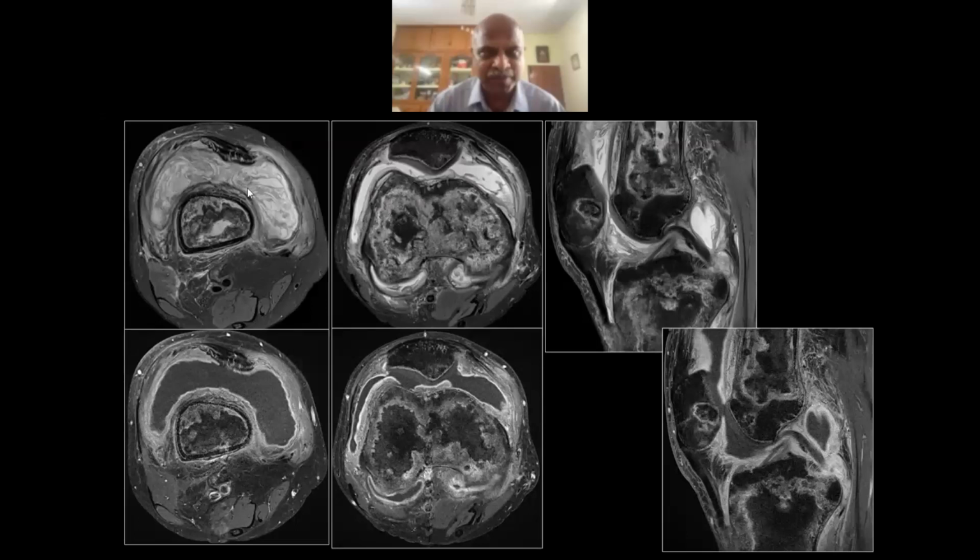And when we did the MR, what we see was that there was a lot of effusion, a lot of synovial thickening, which was lamellated and rather frond-like in the suprapatellar bursa there. A lot of synovial thickening there. That's the PCL recess, which is now opened up. It's almost taking a heart shape there.